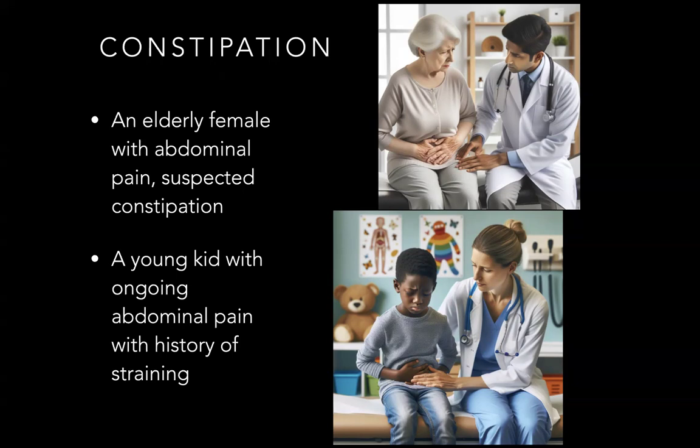You could either treat this clinically because they have very convincing clinical symptoms, get an abdominal x-ray and see if there's a lot of stool on the x-ray, or consider using a non-invasive ultrasound solution.